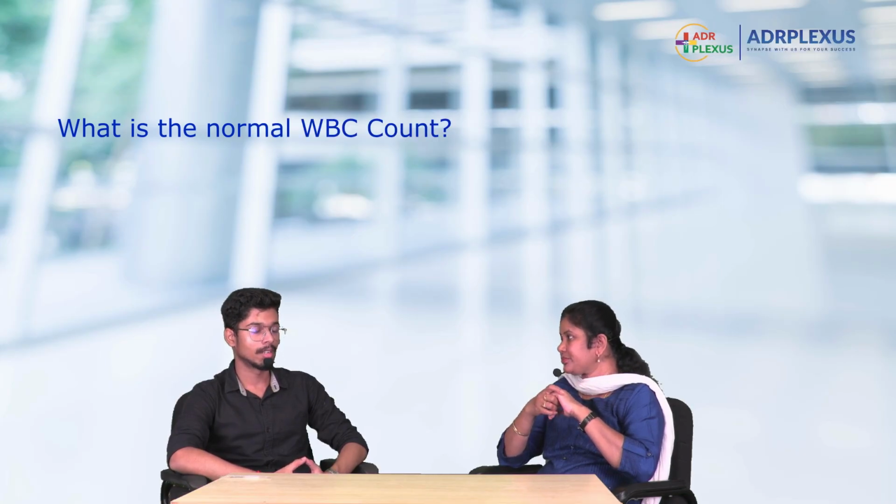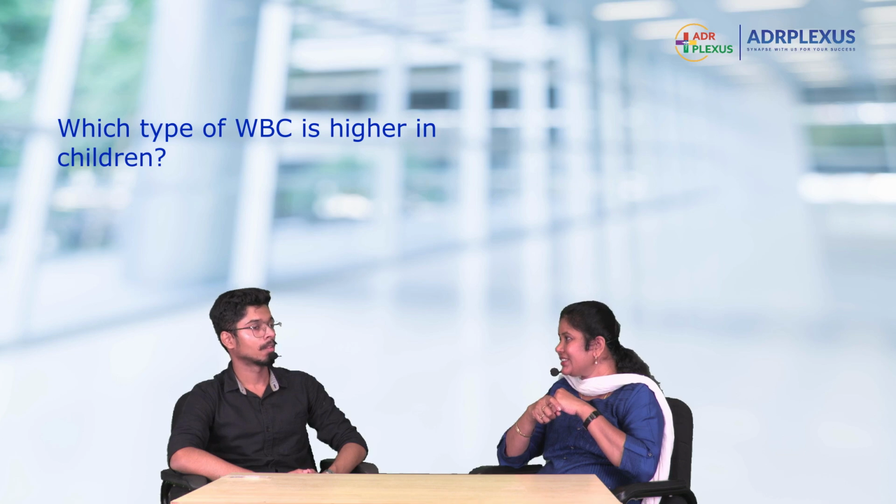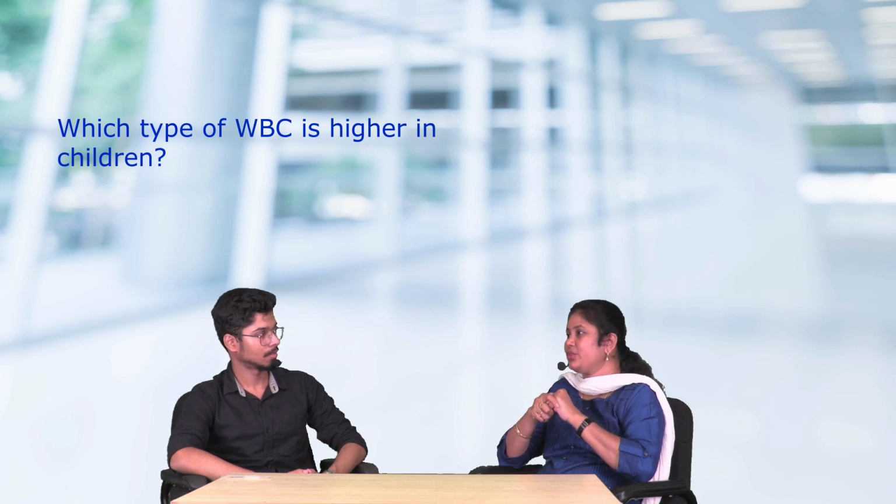Right? Okay. So the final number you have got, you should express the result as cells per cubic millimeter. Yes, ma'am. Right. What is a normal WBC count? It ranges between 4,000 to 11,000 cells per cubic millimeter, ma'am. Okay, fine. This is in adults or in children? In adults, ma'am. In children it will be higher, ma'am. Okay. Any idea which type of WBC is higher in children? Lymphocytes? Yes, very good.